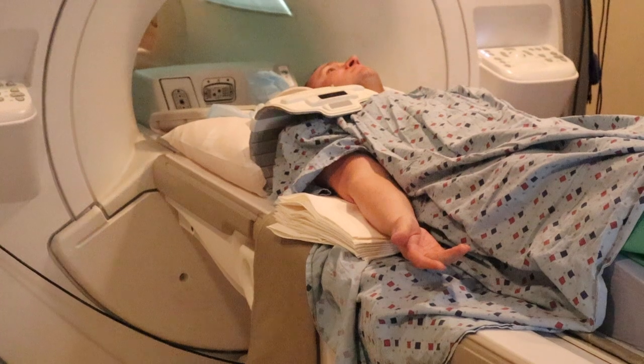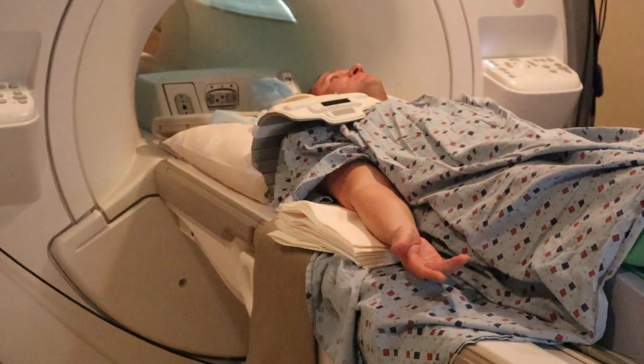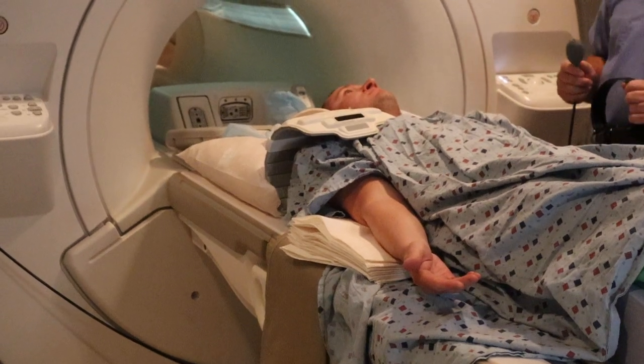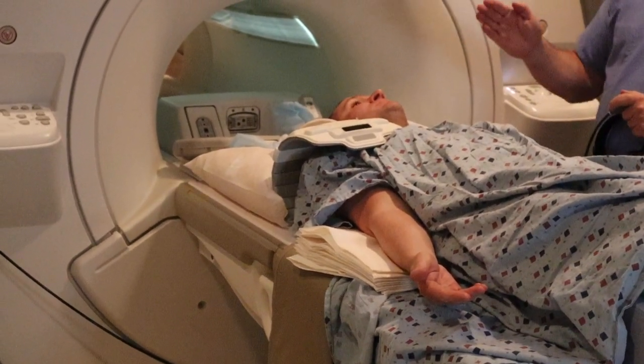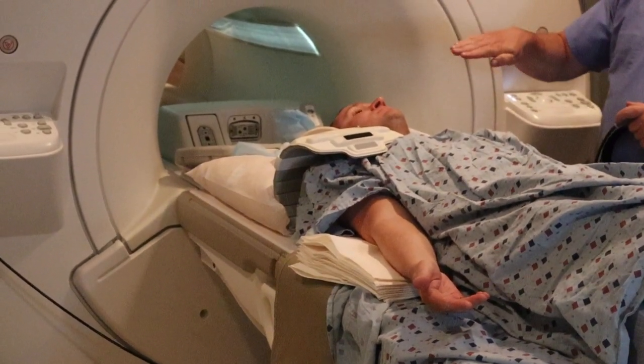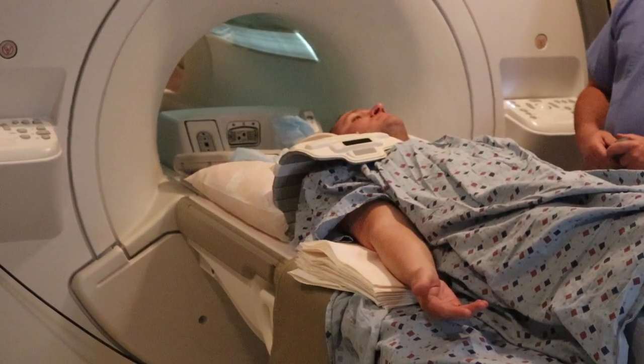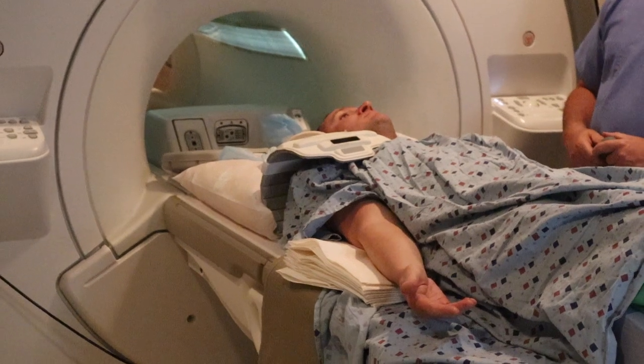This position of the hand is called external rotation. Neutral position would be halfway through. Internal is all the way with the top side of the hand touching the hip. For this exam, you want external rotation.